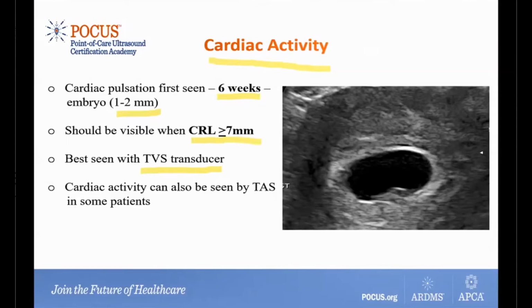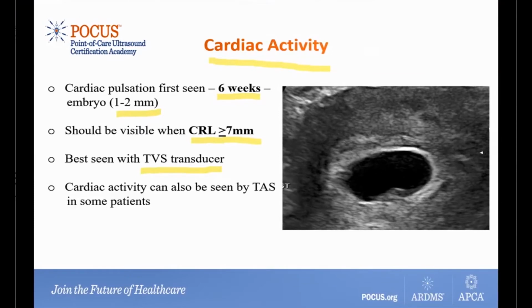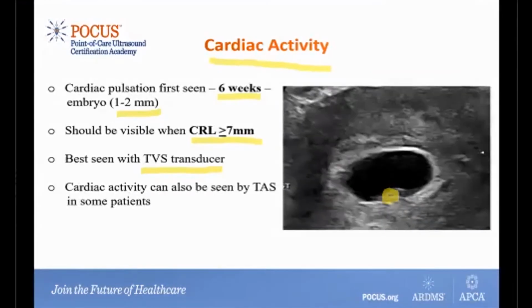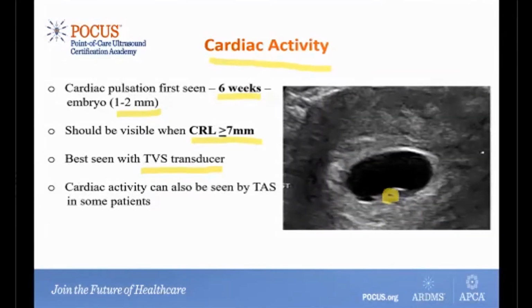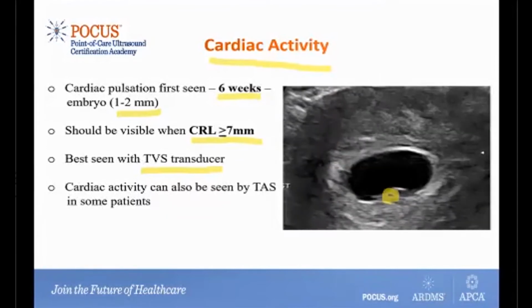And I'm going to see if I can play the video. There you go. You have the video playing now. Very faintly you can see the cardiac activity happening over there. It's a slight flicker, and that is actually the cardiac activity in the embryo.